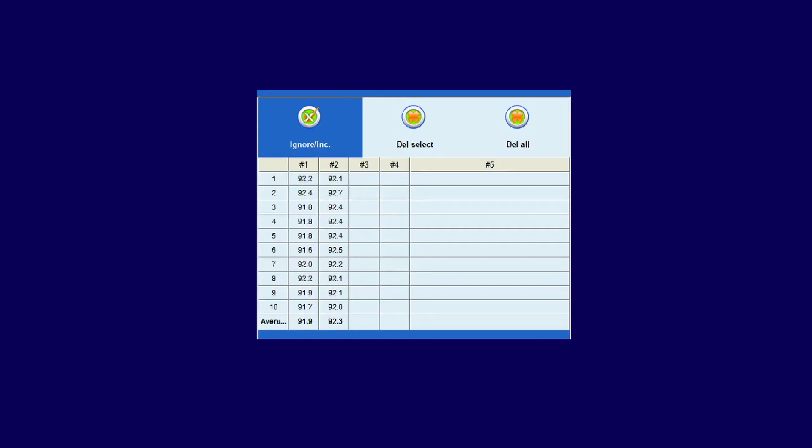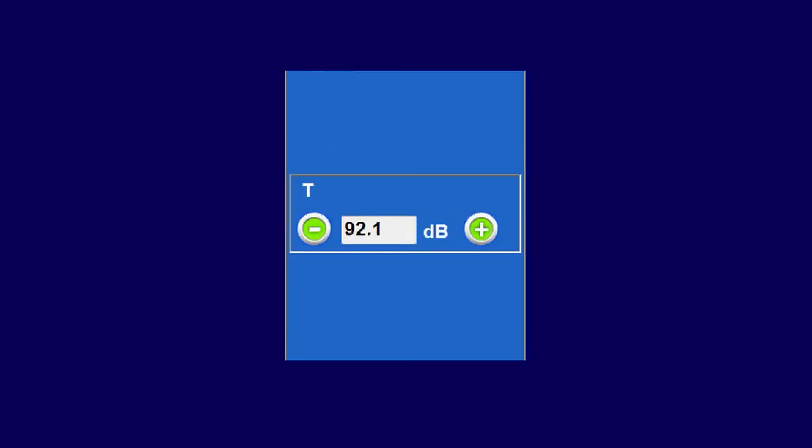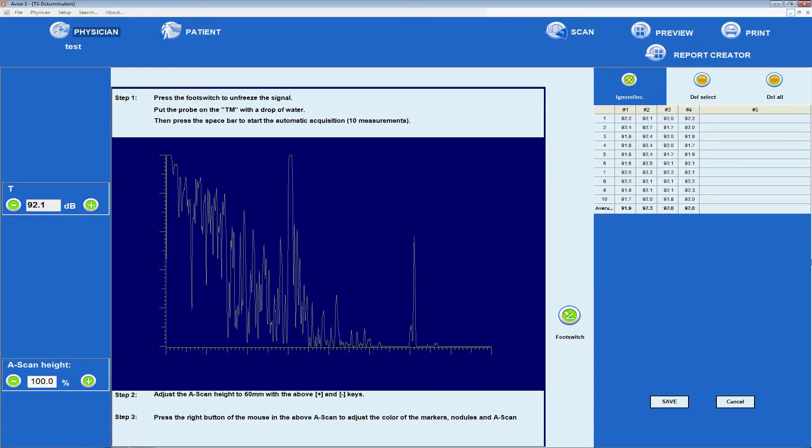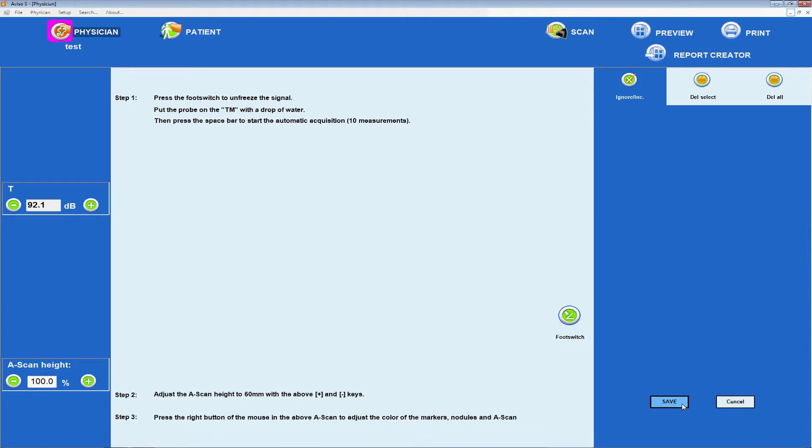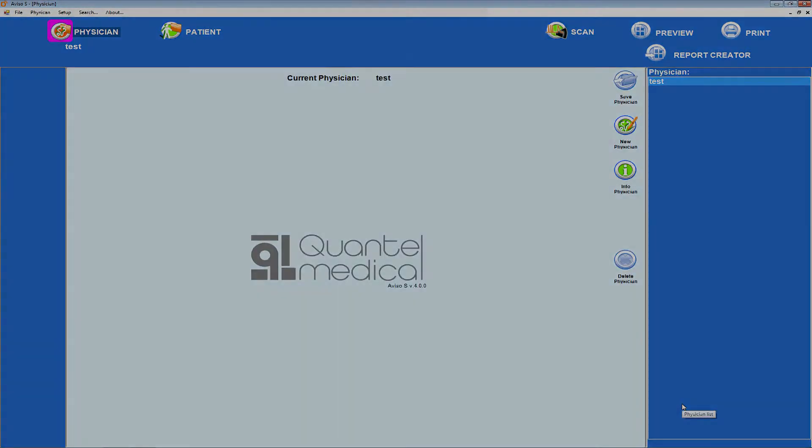In manual mode, the user can adjust the T-gain value in order to achieve a linear decrease in A-scan spikes. Whether performed automatically or manually, when this process is complete, the echographer should press save to validate or cancel to abort.